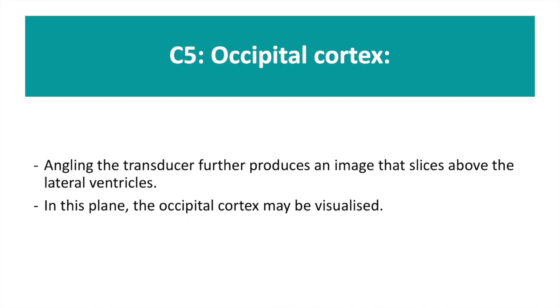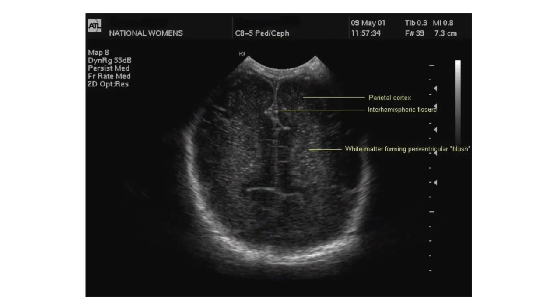The final coronal view, C5, is of the occipital cortex. In this plane, when the white matter surrounding the lateral ventricles appears bright or echo-dense, this is referred to as periventricular flare.